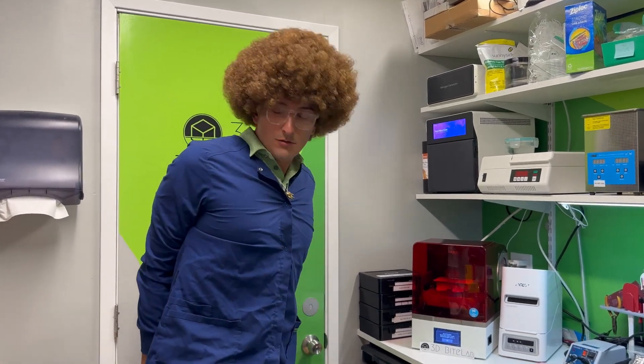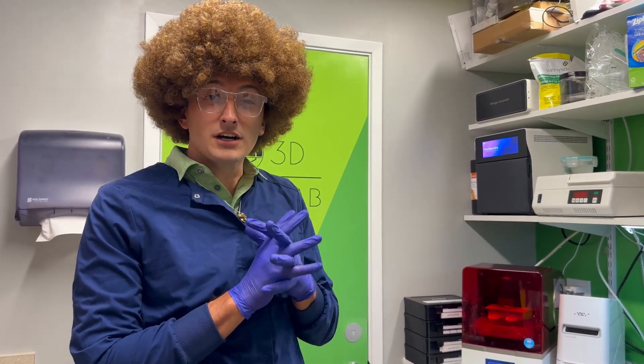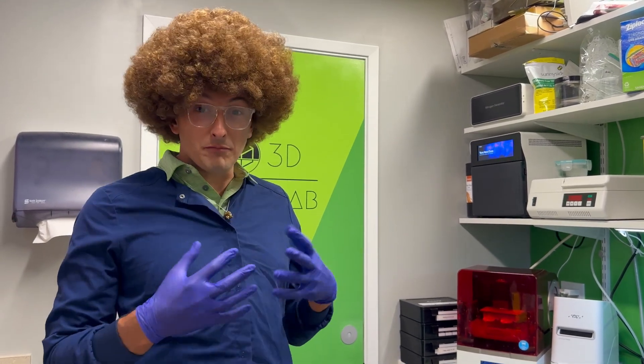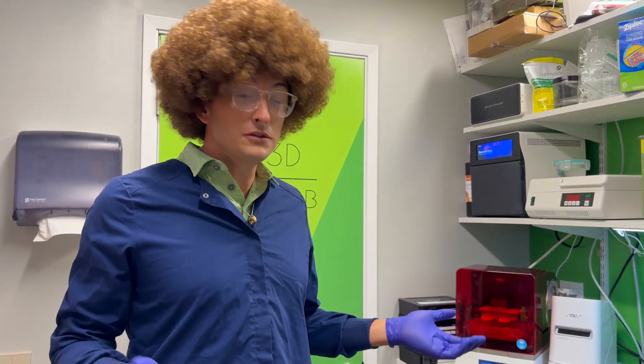Oh hi everyone, Robert Floss here with 3D BiteLab — one of my friends called Bob. Today we're going to be characterizing a couple of 3D printed dentures. One of my favorite things about 3D printing is how customizable the experience can be, even for you, the user.